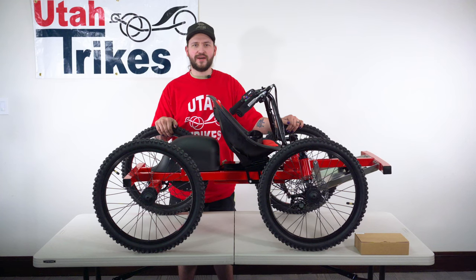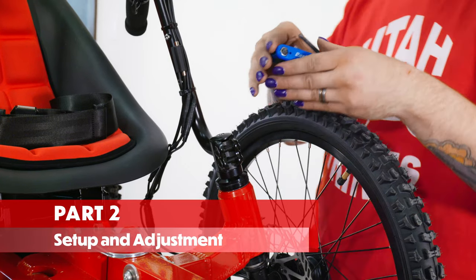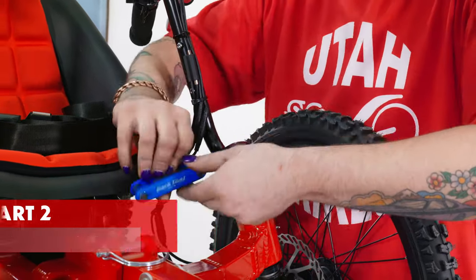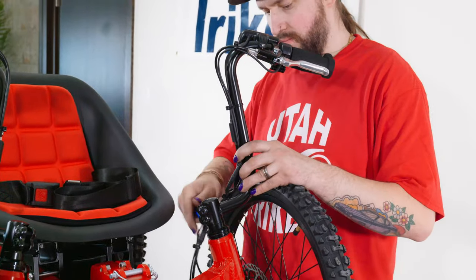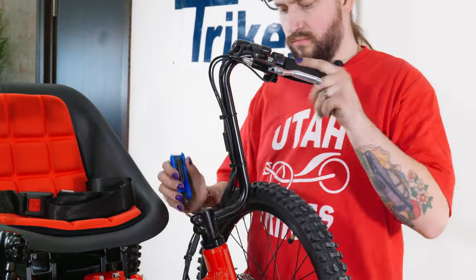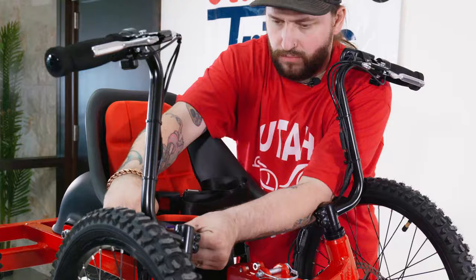The next step is to set everything up for your rider. First, we'll readjust the handlebars using a 5mm Allen wrench to loosen the two bolts on each of the handlebars. Once the bolts are loose, you can rotate the bars in and out depending on the reach of your rider. When you find the right position, tighten down the two bolts nice and tight so the bars don't loosen up while riding.